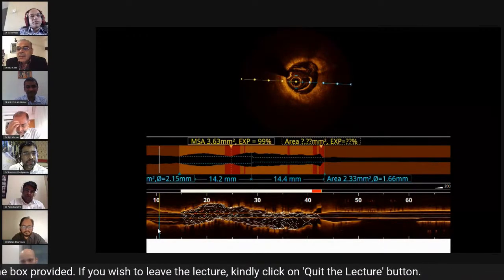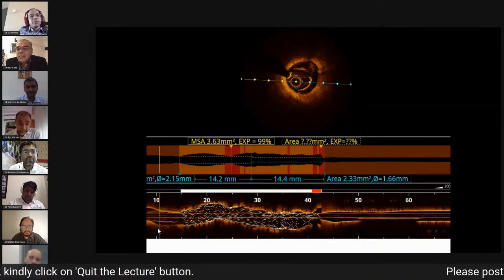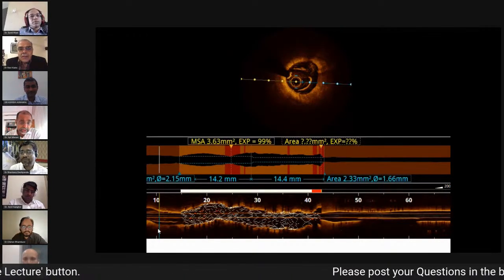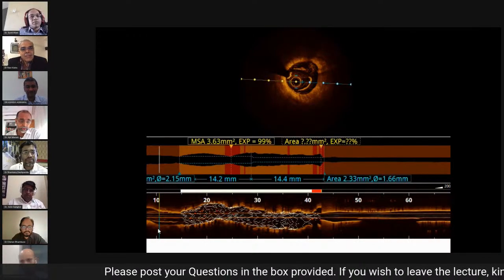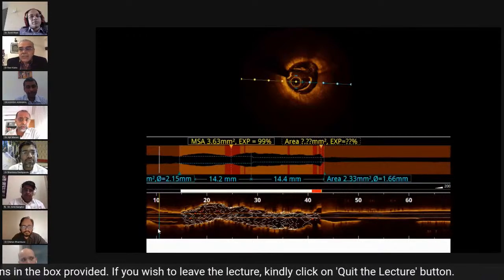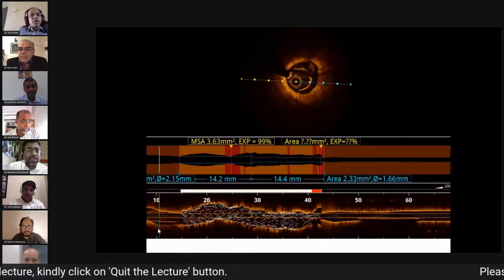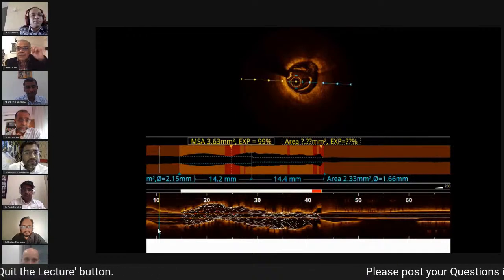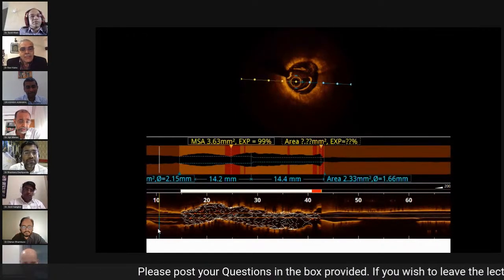We don't have too much data on using an OPN balloon after an IVL, but if after an IVL you still see a waist or you don't get a good expansion on your OCT or on angiographic imaging, it is fair enough to use an OPN balloon to try and dilate the lesion. Again, my contention would be that with OPN also you're generating pressures of almost 50 atmospheres.